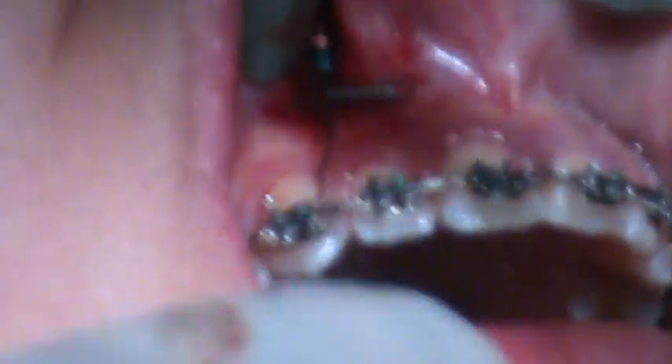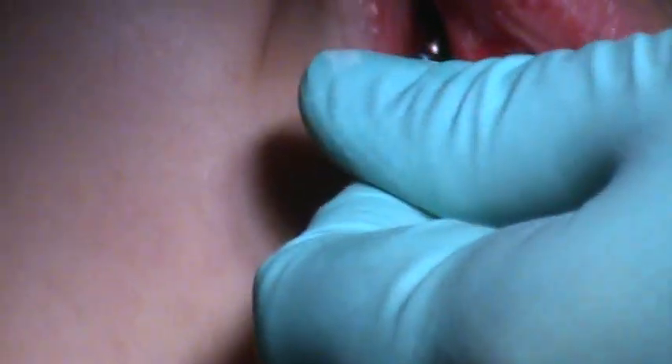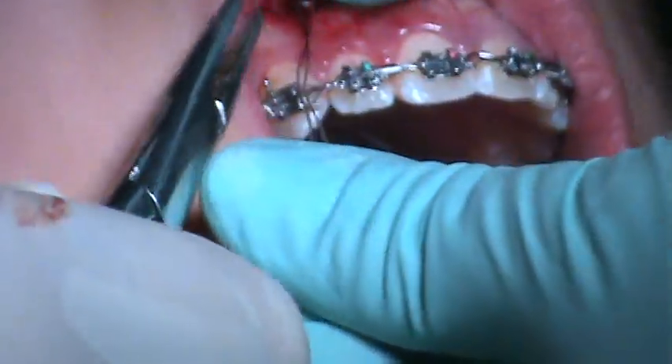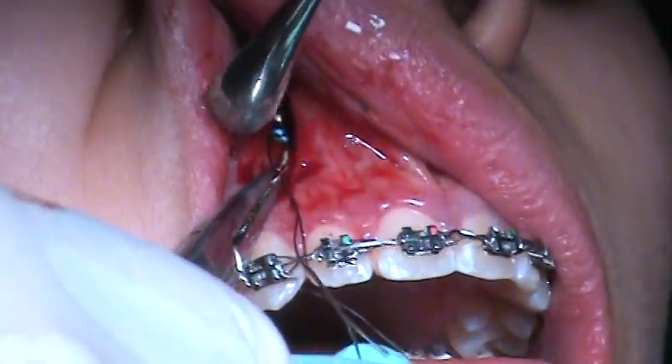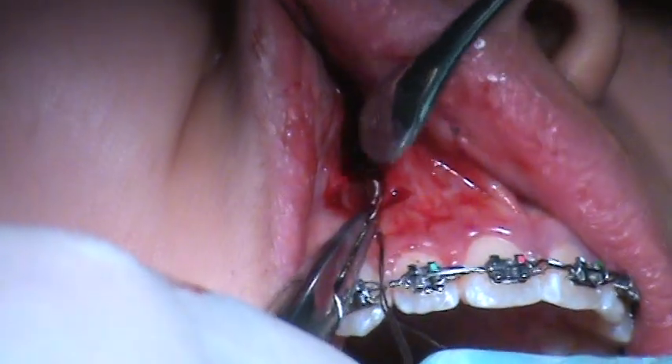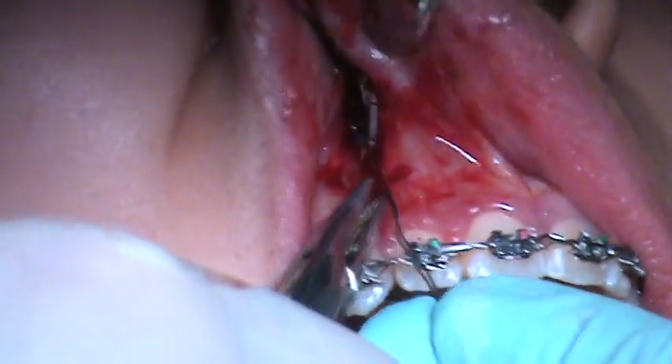And now we need to twist this wire until — let me see here — yeah, now you see if it came out right about there, that would give us six, eight millimeters. So we got to twist it almost all the way to the — it might really twist it all the way up.